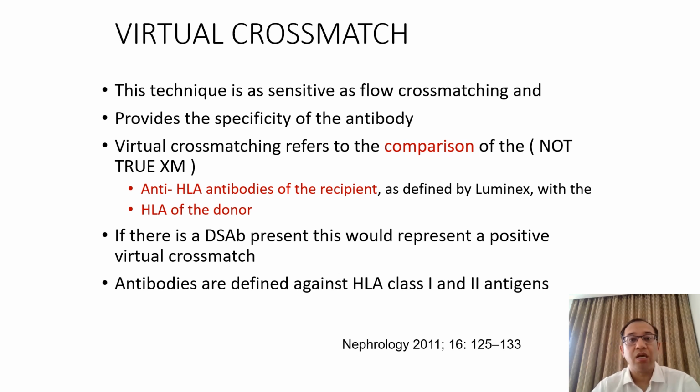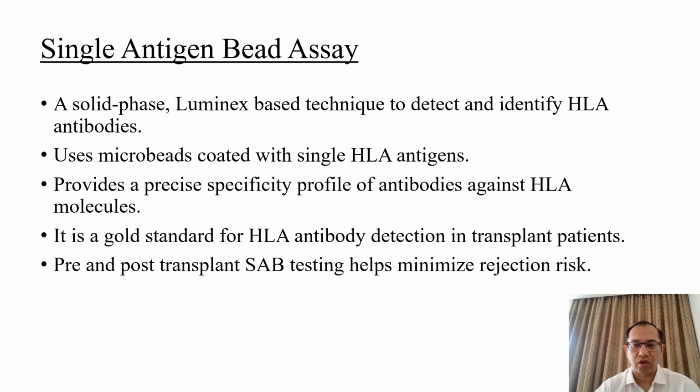So what is a virtual cross match? This we have discussed, but just to reiterate, it is a technique which is very sensitive, as sensitive as flow cross match, and it gives you the specificity of the antibody. Virtual cross matching refers to the comparison of the HLA antibodies in the recipient and the HLA typing of the donor, and you virtually cross match it to know whether the cross match is positive or not.